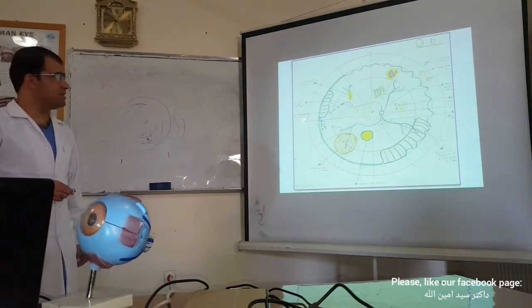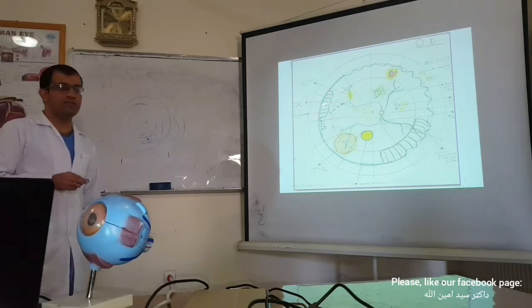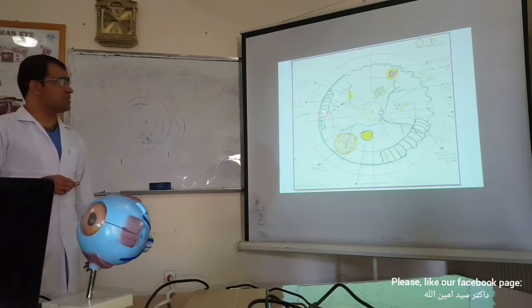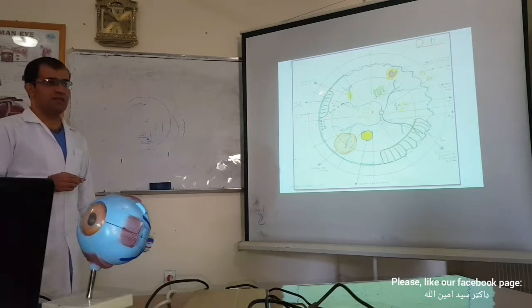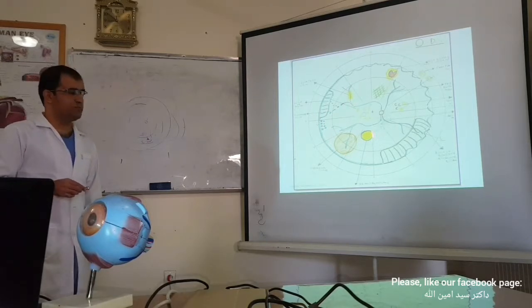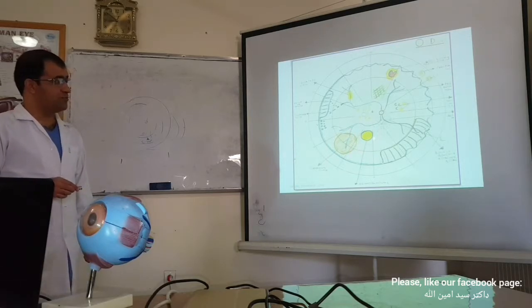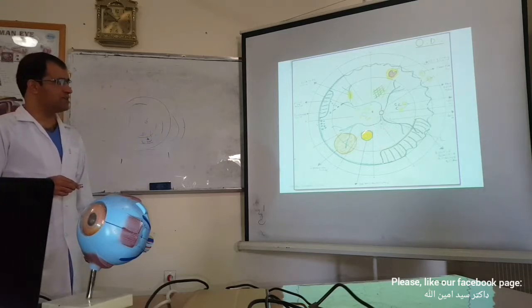What's going to be this lesion? This is again going to be white with or white without pressure. Giant retinal tear is going to have a red area here. But here the red area is not there. It is going to be the white without pressure. And this is the sheathed vein. What's going to be this one? It's going to be choroidal tumor. And this we didn't talk about: retinoblastoma is going to be with blue outline and red and yellow inside.